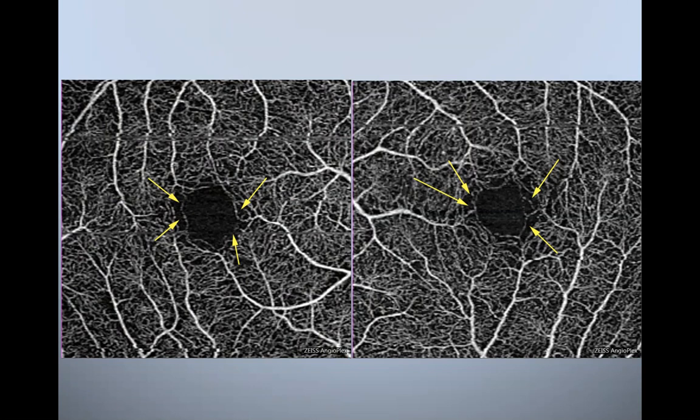It's not dynamic. These parafoveal capillaries are incredibly small, which means that there may be smaller capillaries within this quote-unquote impaired perfusion bed that don't perfuse as fast, or they only allow one red blood cell at a time through, that you're not capturing at that moment in time. So if I scan these patients over and over and over in a one-day period of time, I might see different flow patterns around the fovea. So just be careful about jumping to conclusions with that.